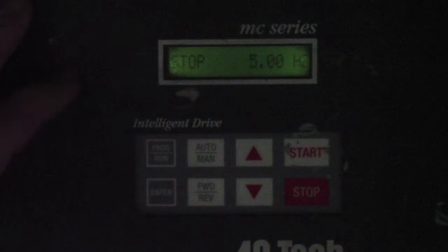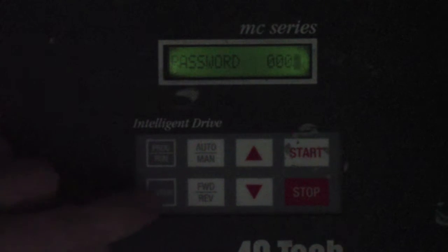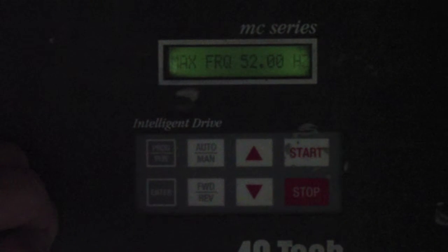First thing we'll do is press the Program Run button. It will prompt you for a password. Go ahead and hit the up arrow to change the password to 0001 and then hit Enter. The next screen that comes up is the maximum frequency parameter, which is defaulted to 52 Hz.